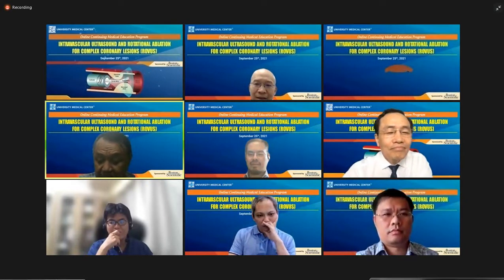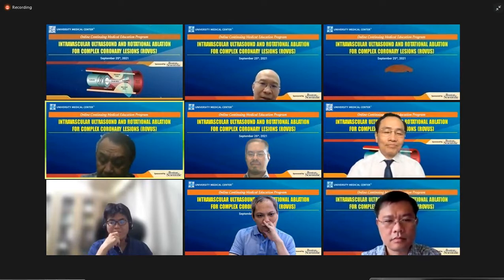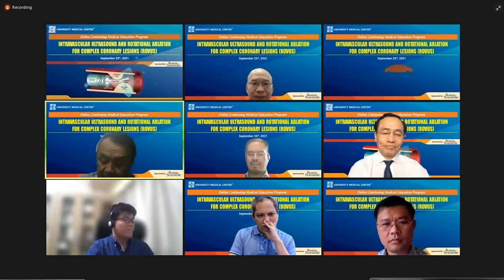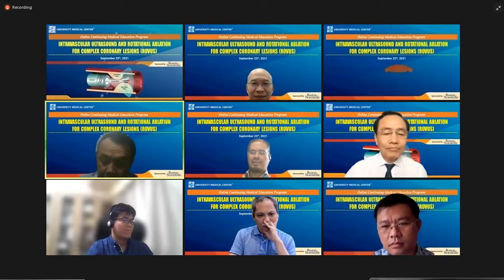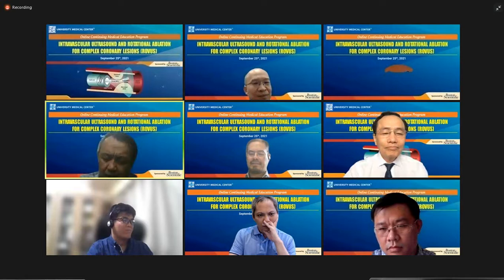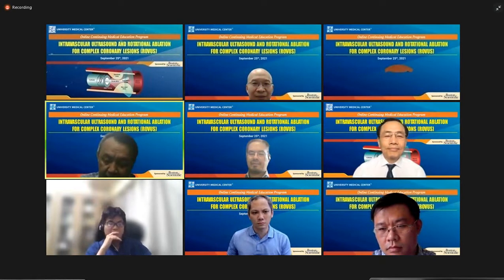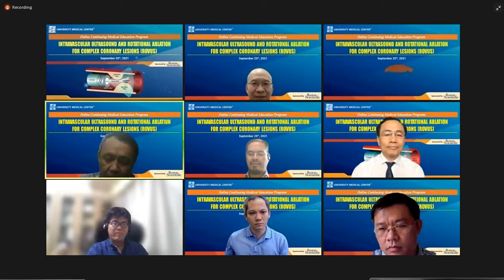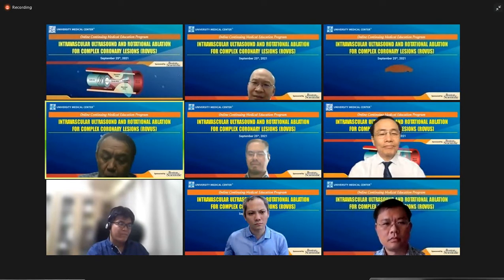The second case, from the Heart Institute from Dr. Duy Phương, is an interesting case for us to share with each other. This is left main disease, which is protected from the circumflex. Very important. In this case, when you did this case, did you use the IABP or not? I would like to ask you one question.